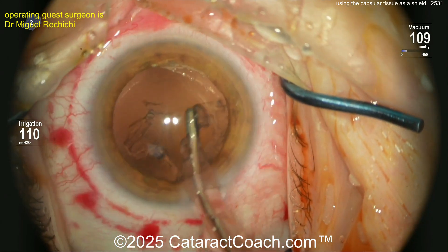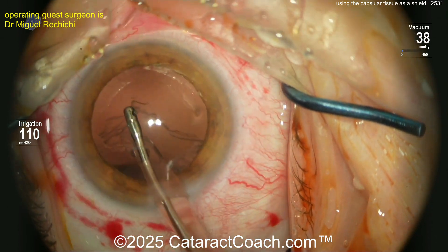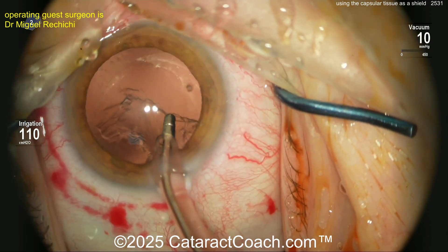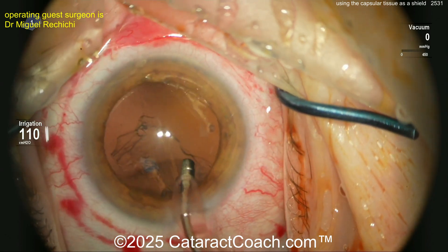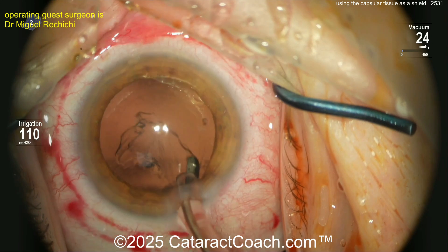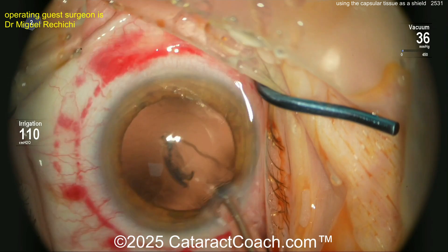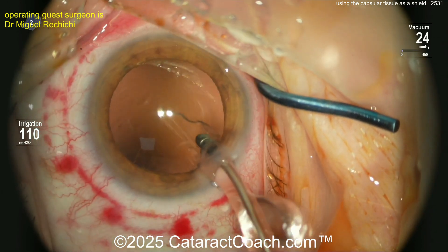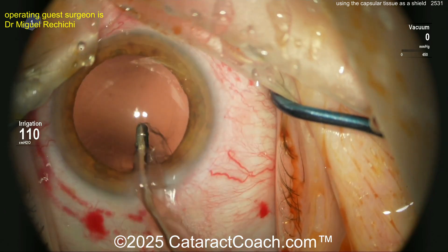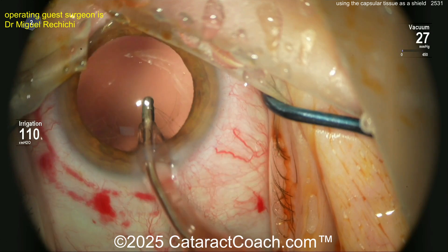Is there a benefit to using femtosecond laser? Honestly, if you have an inexperienced surgeon or one having more difficulty — the bottom half of the bell curve — using a femtosecond laser for every case may be a benefit and may make them a better surgeon. But if you have a top-notch, world-class surgeon, which is what we're all aspiring to be, you want to improve your skills and be able to do a beautiful capsulotomy manually.